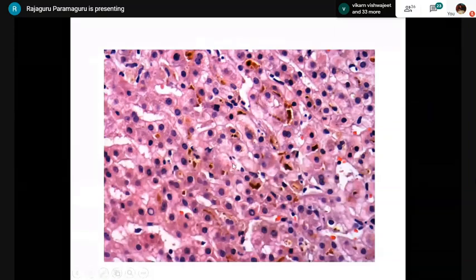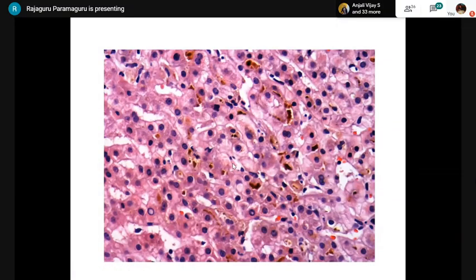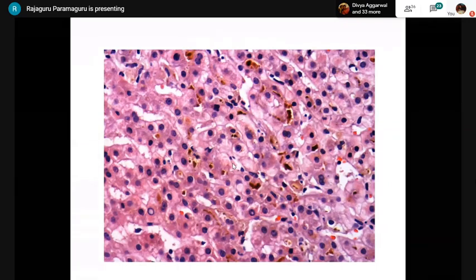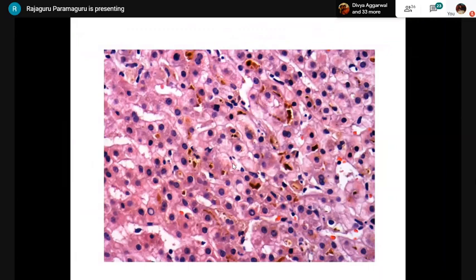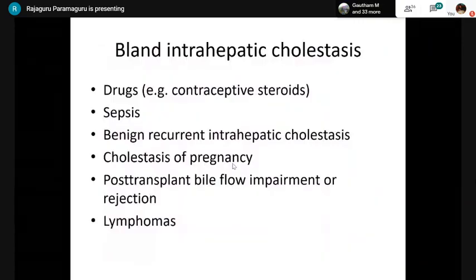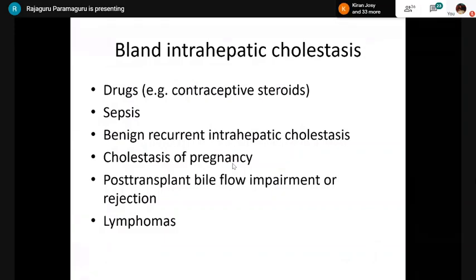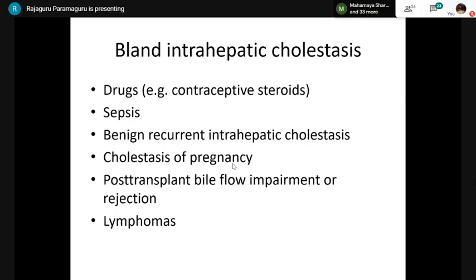Cholestasis: you can see canalicular as well as hepatocellular cholestasis here. In both images, there is obviously no inflammation at all — this demonstrates bland intrahepatic cholestasis. Conditions causing bland cholestasis include drugs such as contraceptive use, augmentin (amoxicillin-clavulanate), benign recurrent intrahepatic cholestasis, cholestasis of pregnancy, and post-transplant setting.